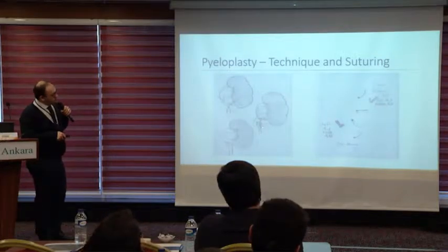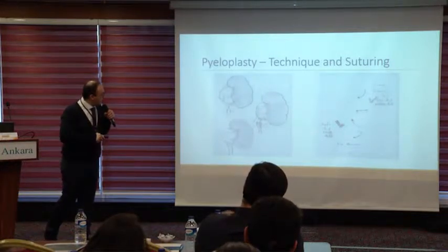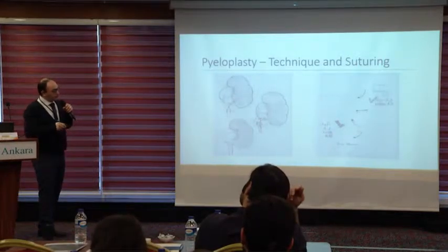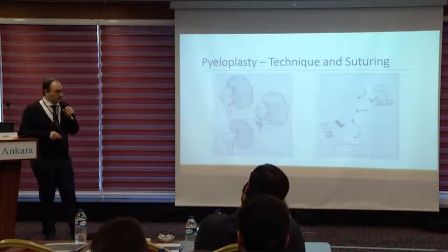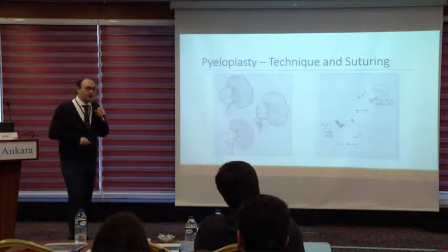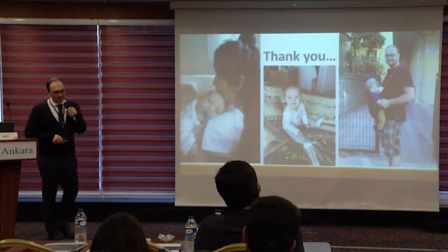But if you place 2 stay sutures at 6 o'clock and 12 o'clock, then you will have 2 linear suture lines on both sides of the stay sutures, and you can manage your sutures with my 2-dimension technique with 0 net movement. The 0 movement will give you more time and will make your operation better. Thank you.